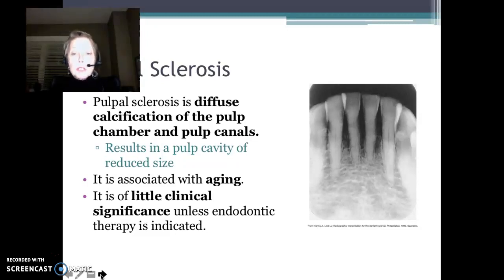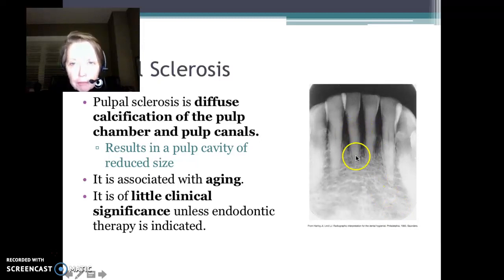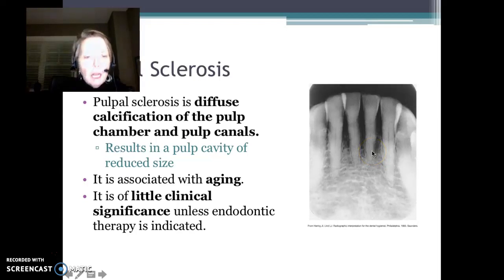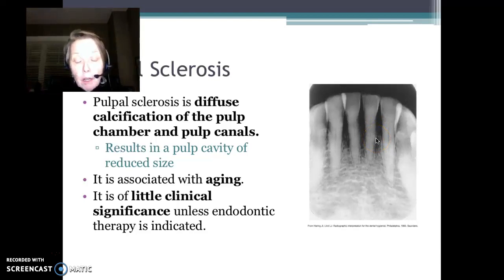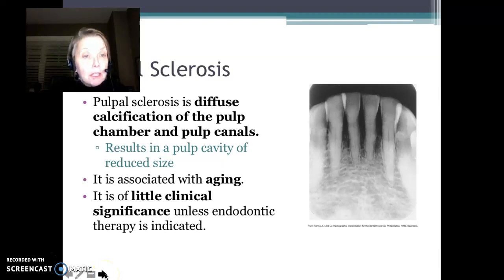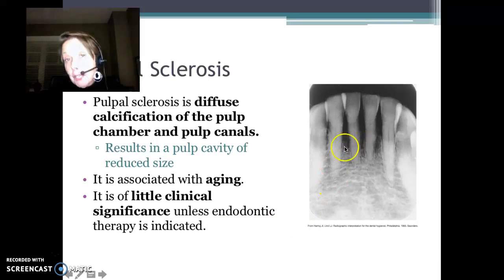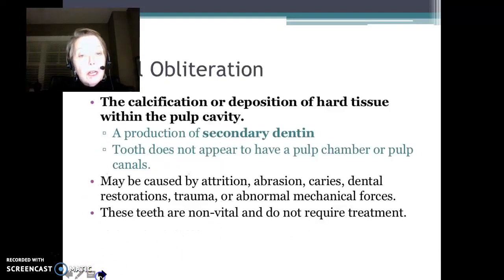Pulpal sclerosis is a diffuse calcification of the pulps. Take a look at teeth 24 and 25 and just how very thin the pulp canal or pulp chamber has gotten. That's a result of aging — as we age, the pulp chamber narrows. No clinical significance unless root canal treatment is required, because then it's pretty hard to get into those canals. But typically, no clinical consideration.